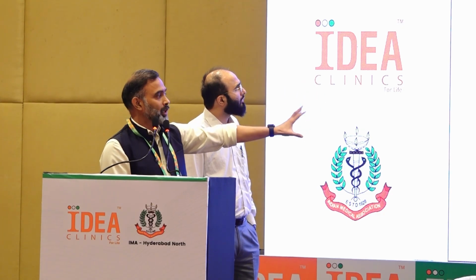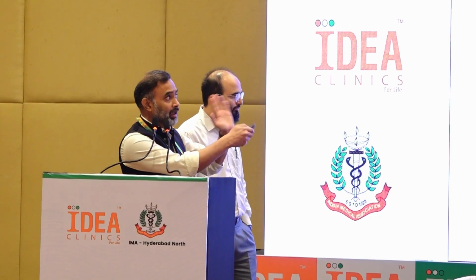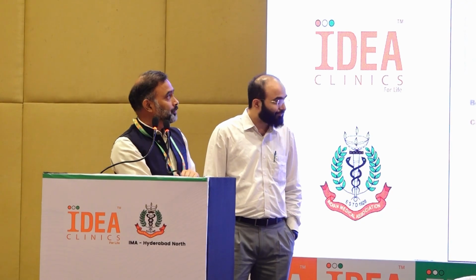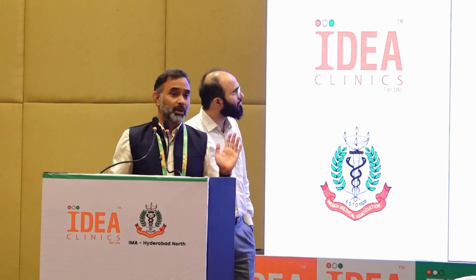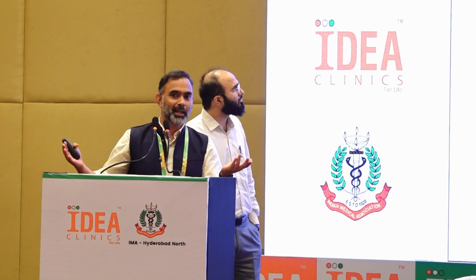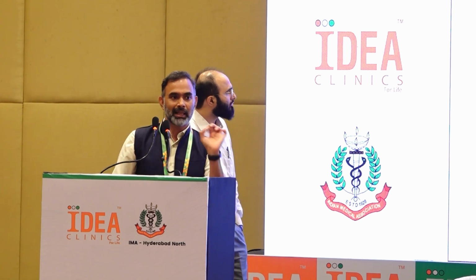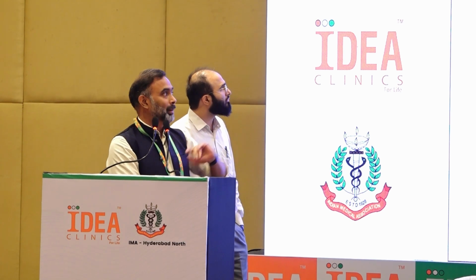All of this data, once you are aware, we'll do separate workshops where I detail how to read this data as well. And once that is done, the patient is done. A lot of my pump patients are actually not coming to follow up, because the pump takes care of everything. My role is just to tell the pump how much insulin to give initially. After that, it is all up to the pump.